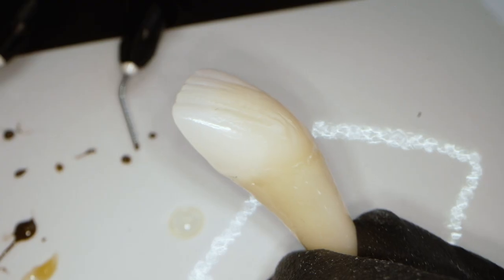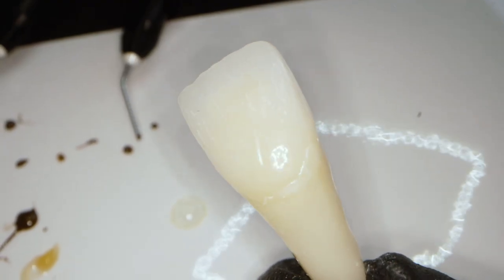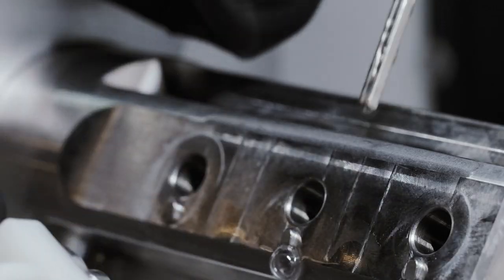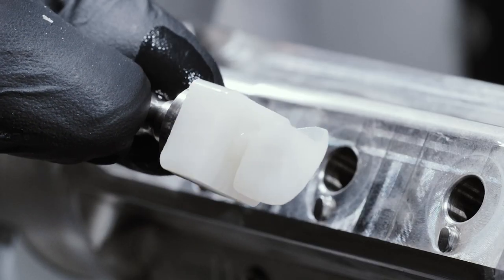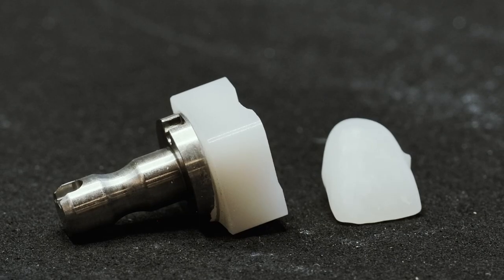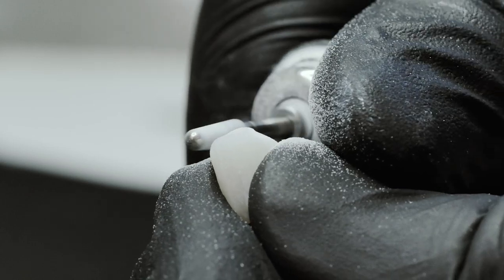As we all know, applying colors to the outside is neither realistic nor long-lasting. I take the milled crown out of the machine and can start immediately with the staining and special effects that I want to include in my final restoration.